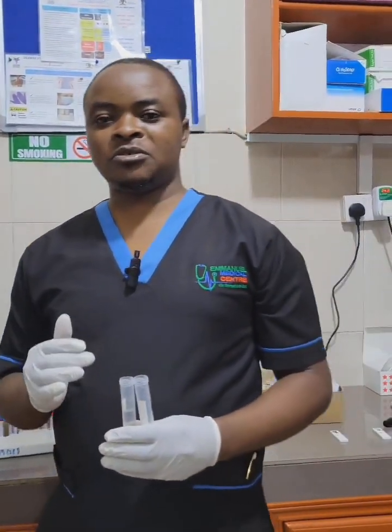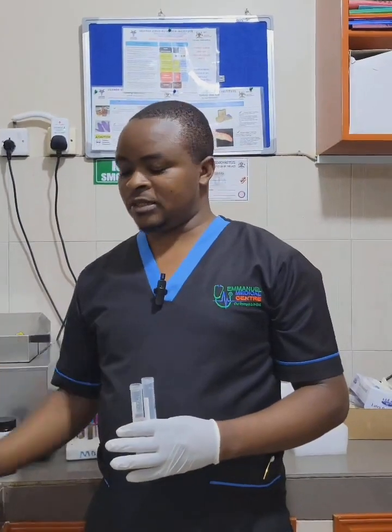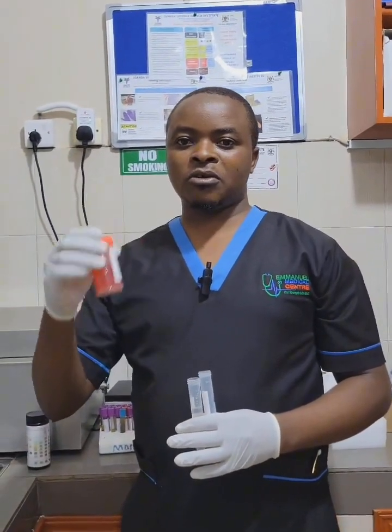In this session, we are taking you through a practical on how to perform urine microscopy. After you have seen the appearance, that is macro, and you have done the biochemical test using a dipstick, how do you process a urine sample from the patient for microscopy?